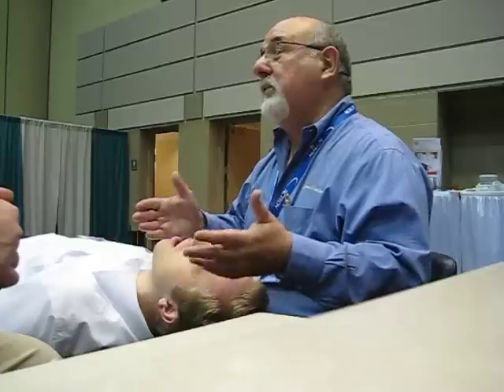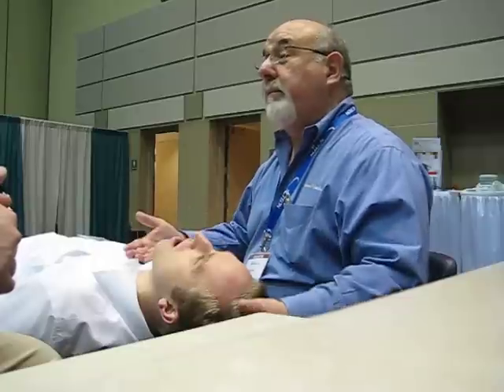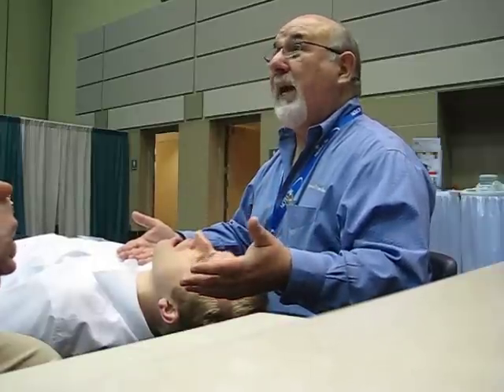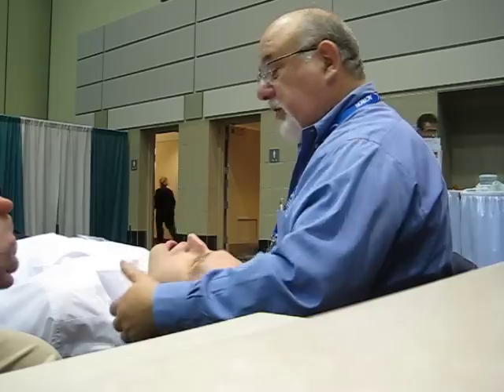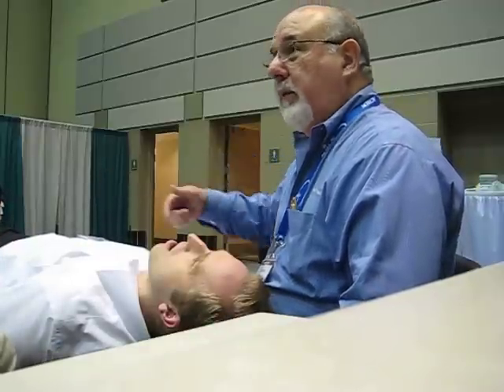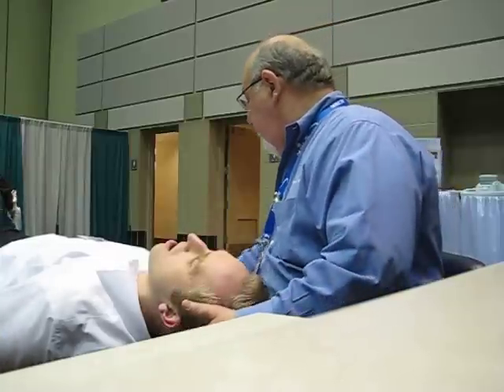Unless a patient tells you that they sleep sitting up, if they sleep laying down, you can get them to this position, but you have to do it gradually. And you can't bring them up quickly either because they'll get dizzy. So basically what's happening here is I can do anything because of this. Now, the old Cascade chair had a convex back, which stiffens the neck muscles. It's the most uncomfortable chair. The other thing you want is a knee break so that it lowers the stress on the back, and good lumbar support.